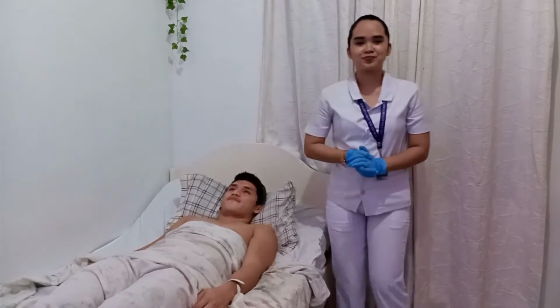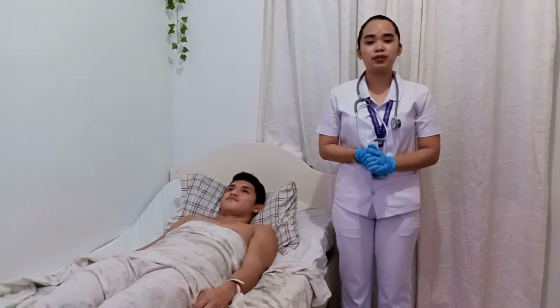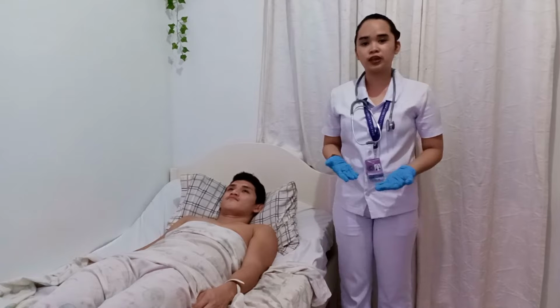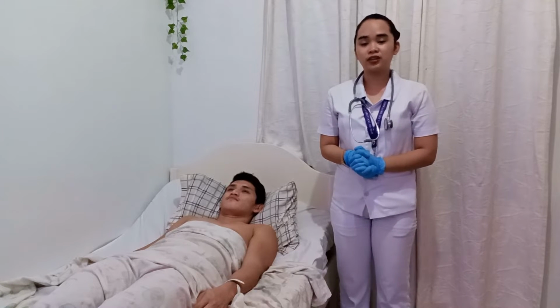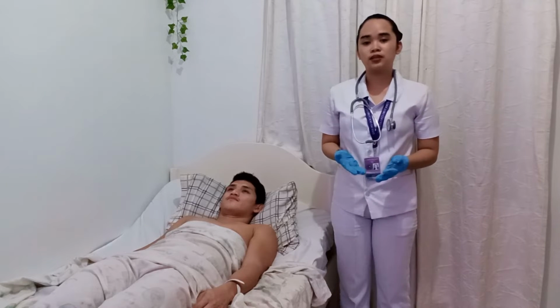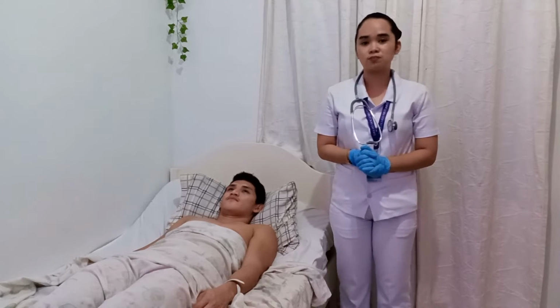Next, instruct the patient to turn his head slightly away from the side being examined and place the bell of the stethoscope over his carotid artery. Ask the client to hold his breath for a moment and auscultate the carotid artery for bruit. So bruit is an audible vascular sound associated with turbulent blood flow, which is an indication of occlusive arterial disease.